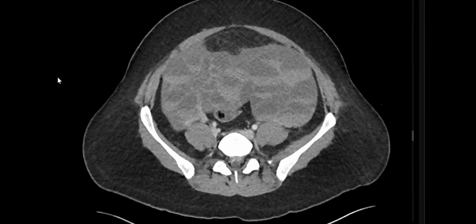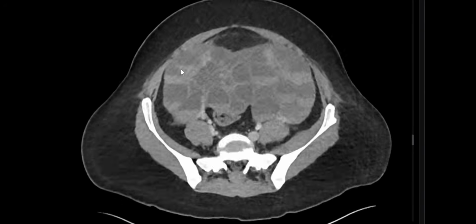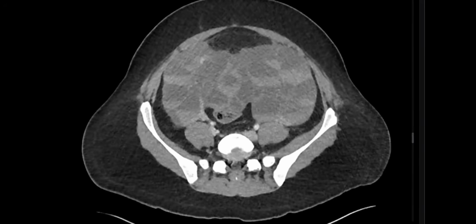Very good, my friend. The last one. No, hemorrhage is a common occurrence here. It's a very common association. When rapid enlargement occurs, hemorrhage occurs. It's actually a highly suggestive sign.